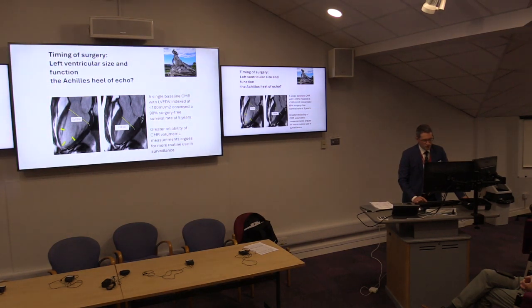So, not dissimilar to the aortic, the guidelines still talk about two-dimensional measurements of the ventricle. I think we should go beyond that, and I'm hoping that we'll see changes in that soon. We've got pretty good reproducibility for 3D LV quantification on echo, but also on CMR, and I think that will come.